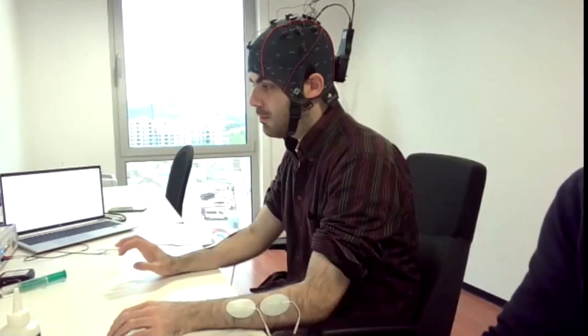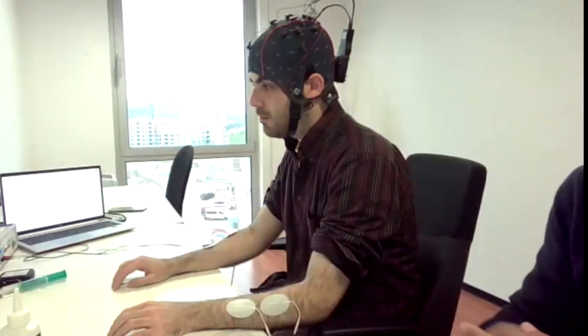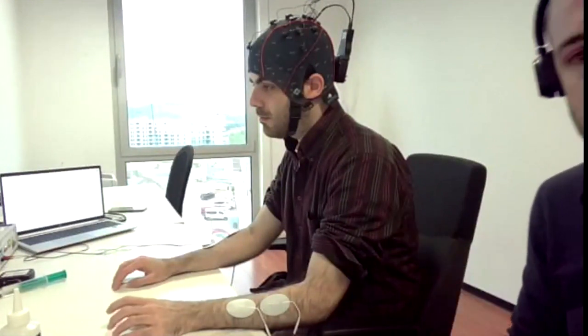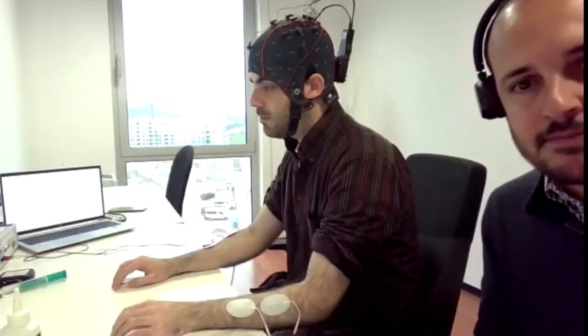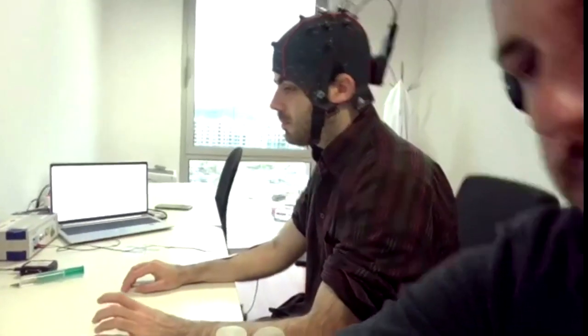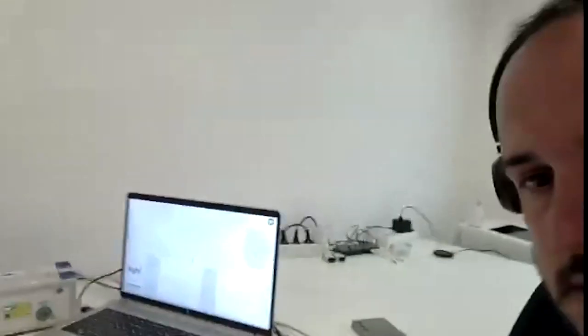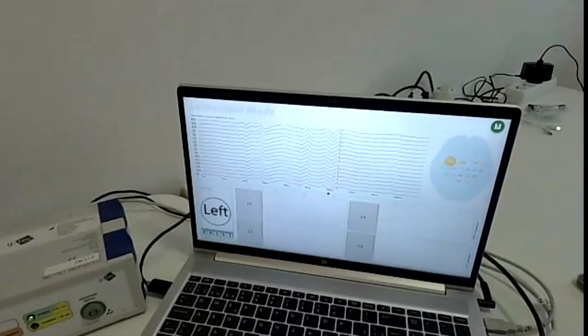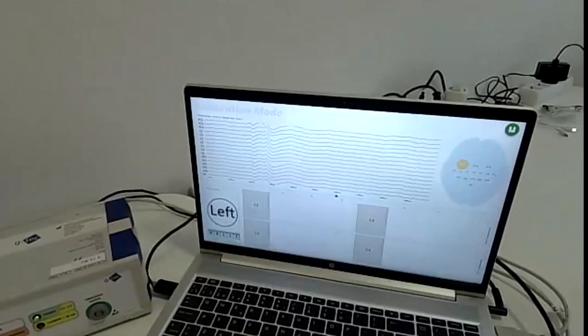It's recommended that during the session the patient is more focused. It's recommended that we don't talk next to the patient and we don't walk around. Mark, at the moment we are just seeing Dani. Do you also want to show the screen a little bit? I will try to move my computer. I'm not sure how much we'll be able to show. Before, I was doing some tests, and the computer of the therapist was correctly shown. Now the light changed a bit. So wait. Okay, now we can see it.